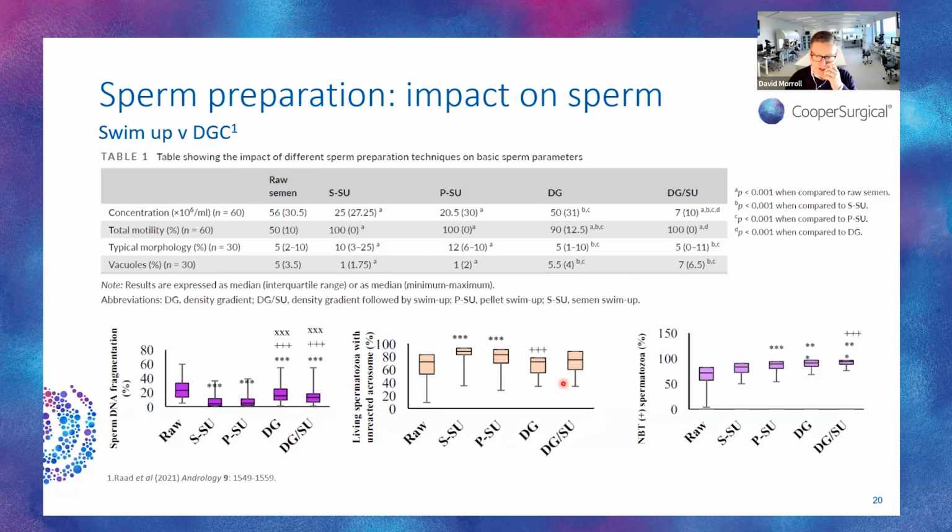They have an impact on the proportion of sperm with unreacted acrosomes and so on. But the overall message is that you can see in different studies some slight differences between these techniques. Some will suggest a swim up is better than a density gradient. Other reports show the opposite. The overall picture seems to be that if you do a good quality sperm preparation by your chosen method, you will be improving the morphology, the motility, and the DNA fragmentation, and they can work pretty much equally well, I think. Now, there are some caveats to that.